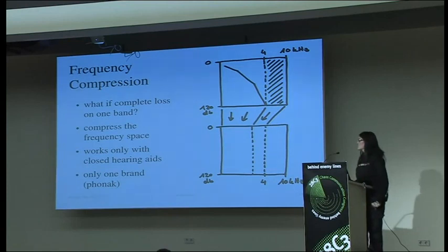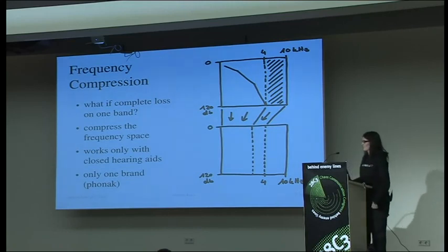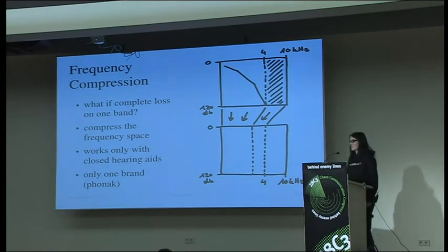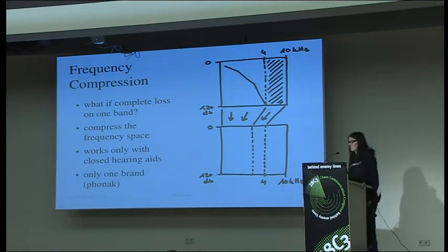This is called frequency compression, and it works only if you have closed hearing aids, meaning those where you cannot hear natural sound anymore, where the ear canal is really blocked by the hearing aid, because otherwise it would be really confusing. And this is actually offered by only one brand right now, a company called Phonak. And it's actually quite hard to get used to that. The brain has to adjust to that for a very long time, from what I heard. I mean, I don't have this. But still, it's interesting that they try to do it like that.